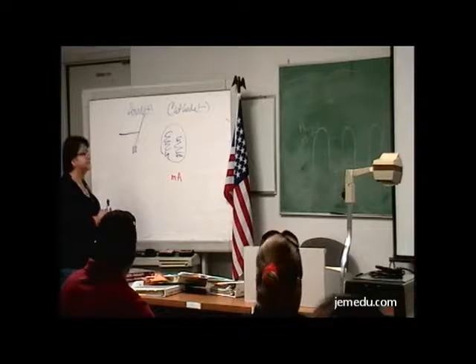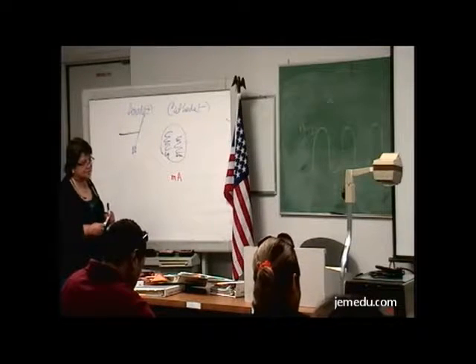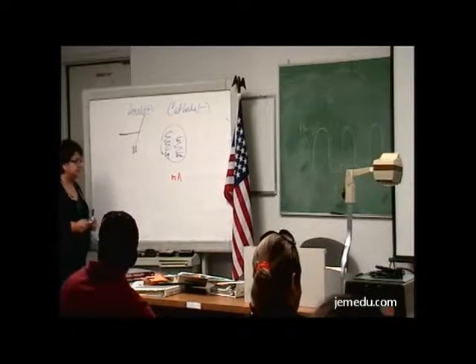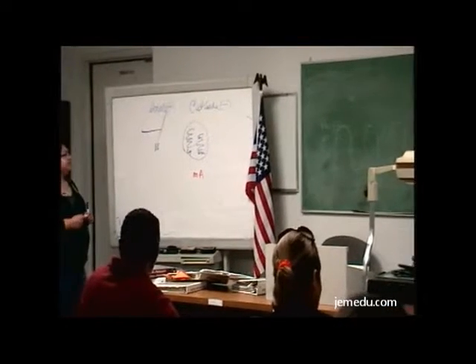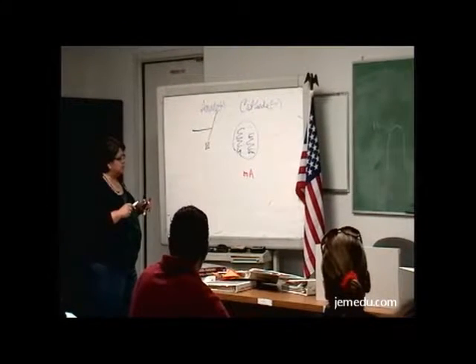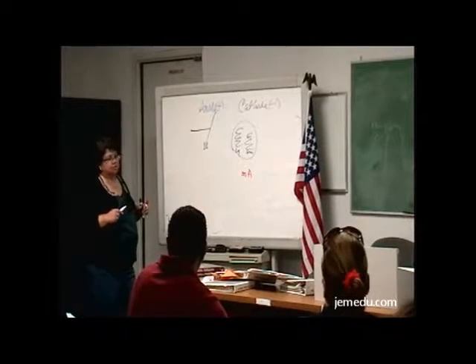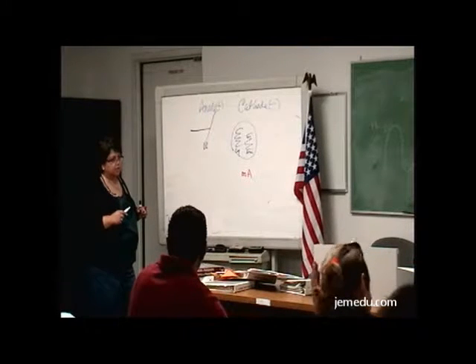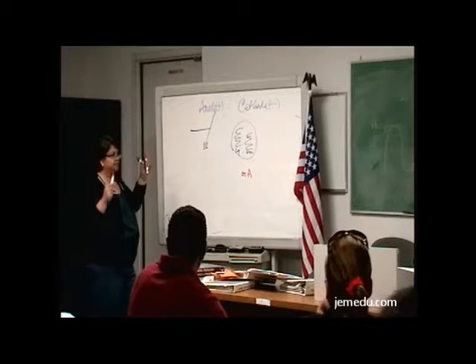Okay, milliamperage. Milliamperage is our friend. We can't do anything without it. We have to have milliamperage in order to have X-rays. So, as we're talking about the X-ray tube, we can finish it by adding more things to it. What else should we add to the X-ray tube to finish the design of the tube?